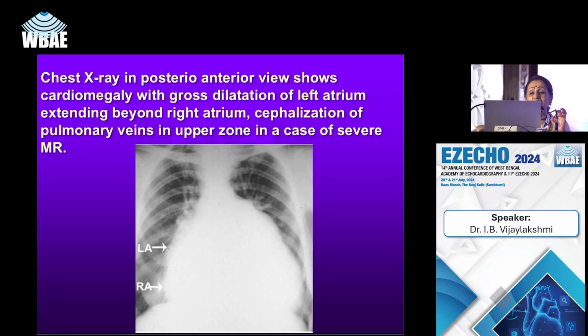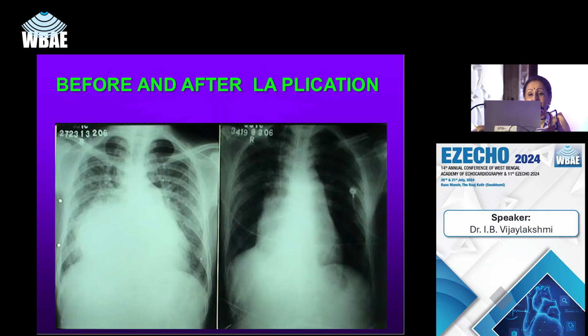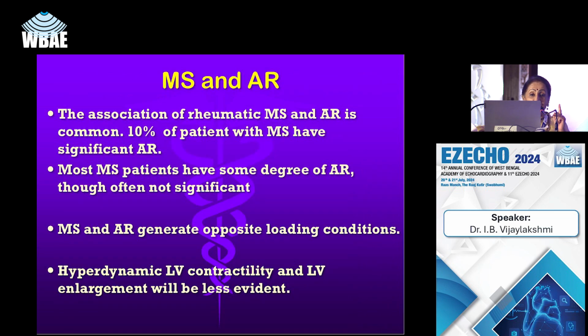So friends, echo plays a major role in prevention, treatment as well as the prevention of complications. To conquer rheumatic heart disease, we have to use the echo criteria and be specific about what we do. Echocardiography is the key technique used to confirm the diagnosis of the valve lesion. All quantification methods to assess severity of the valvular lesions have limitations. They combine a number of measurements, therefore their use requires experience and integration of a number of measurements rather than reliance on a single parameter.